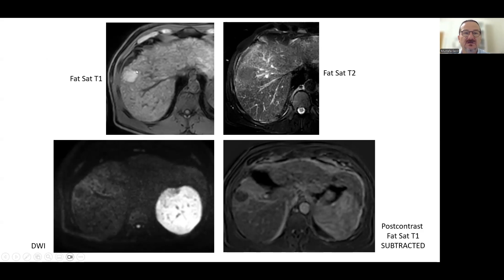This lesion appears bright on T1 because of the iron content, which also makes it hypo-intense on T2-weighted images. The lesion does not display diffusion restriction and no contrast enhancement. As the lesion is bright on T1, we need to use subtracted images to evaluate the vascularity of the lesion.